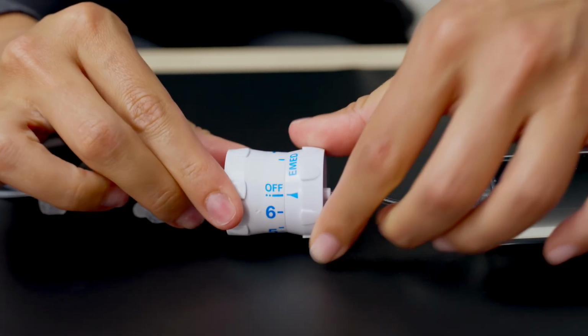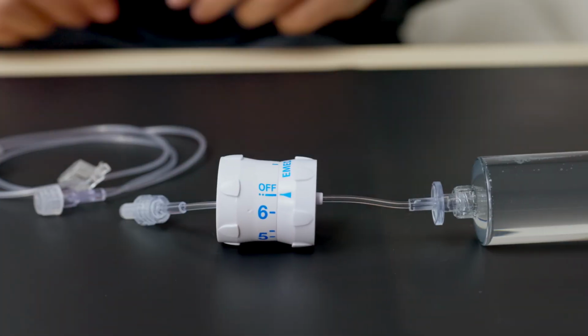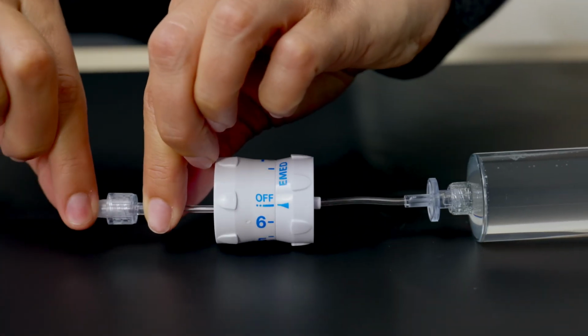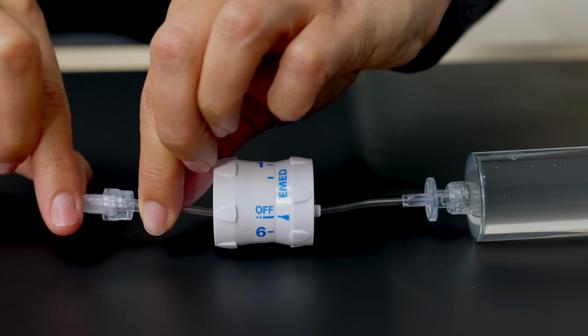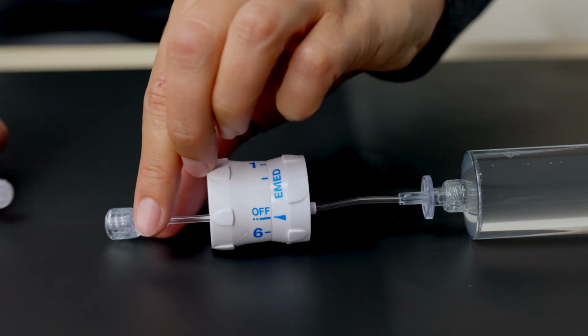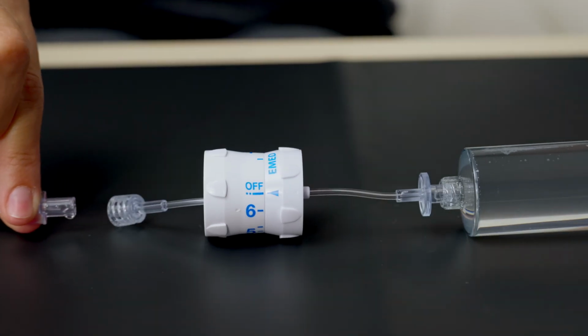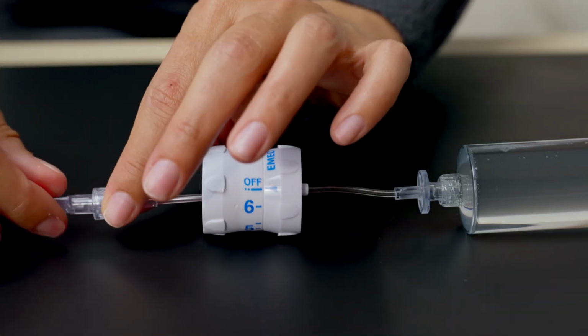Ensure the VersaRate flow controller is set to the off position. Next, remove the luer lock cap from your needle set and the other end of your InfuSet or VersaRate flow controller using aseptic technique. Connect your InfuSet or VersaRate to the OptiFlow needle set using a twisting motion while making sure not to over-tighten.